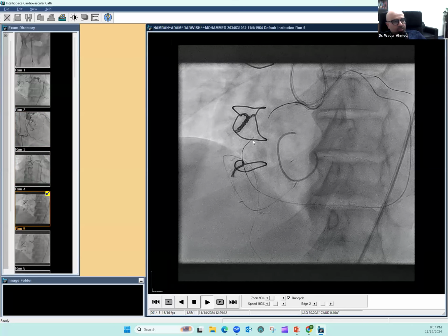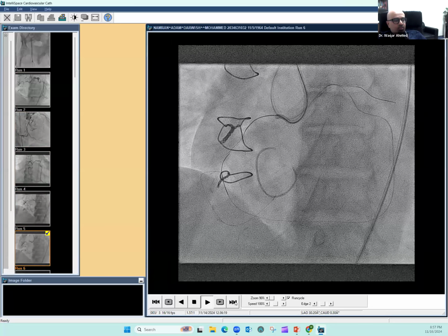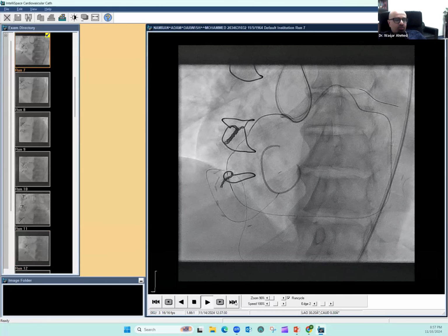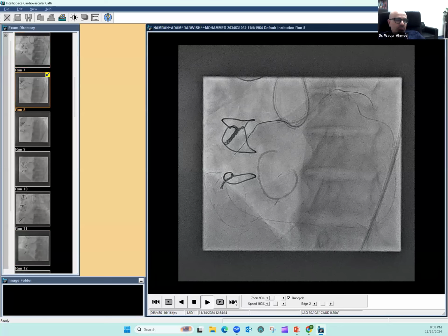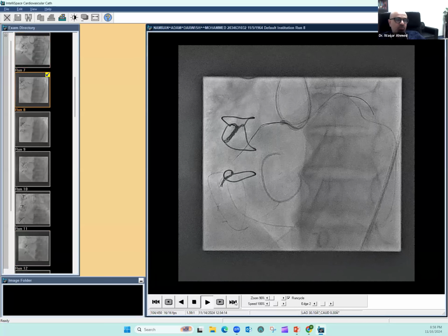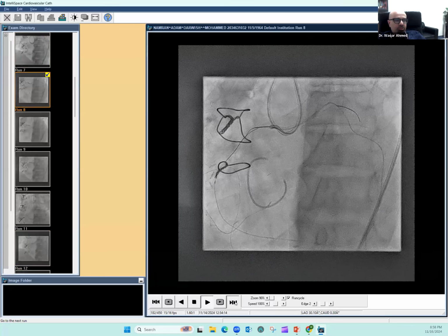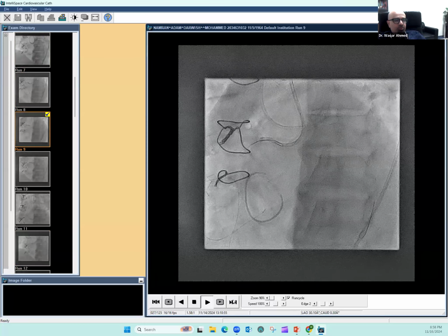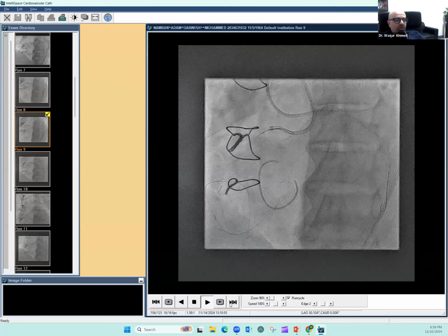So I have the marker wire distally and went down with the Fielder XT, and then a Gaia second. And I wanted the 2 wires to meet and be friends, but they would not meet each other. I tried my best. So I gave up the antegrade and went retrograde. So I changed the wires from retrograde from a workhorse to a gladius wire. And the gladius wire, with pretty much gentle manipulation, went up, and I was able to capture it in the guiding catheter. So here we confirmed we're up there.